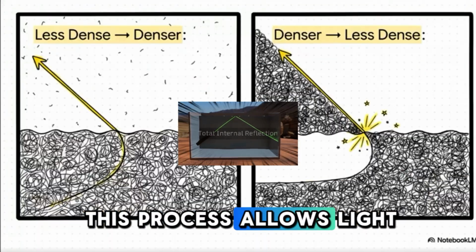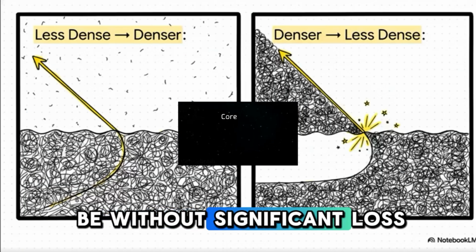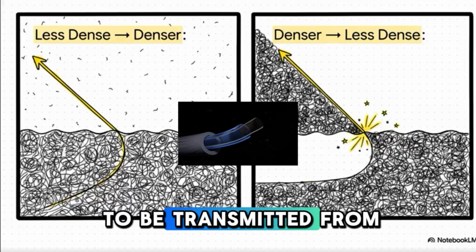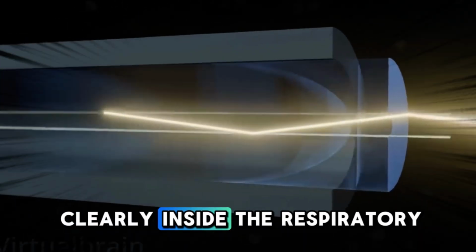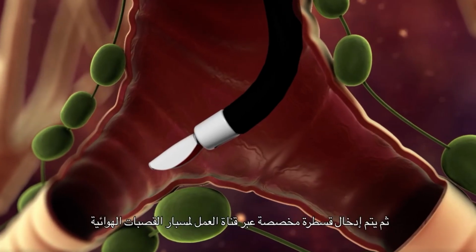This process allows light to travel over long distances without significant loss, and it enables clear images to be transmitted from deep inside the lungs to the camera. Without this principle, it would not be possible for doctors to see clearly inside the respiratory system during bronchoscopy.